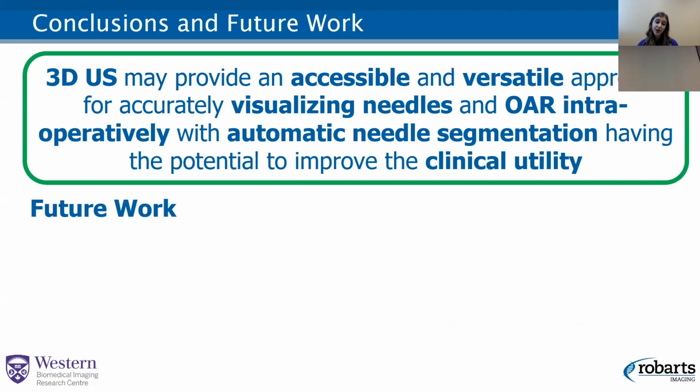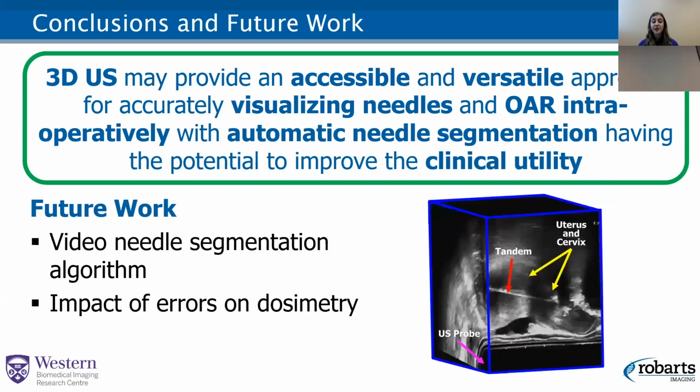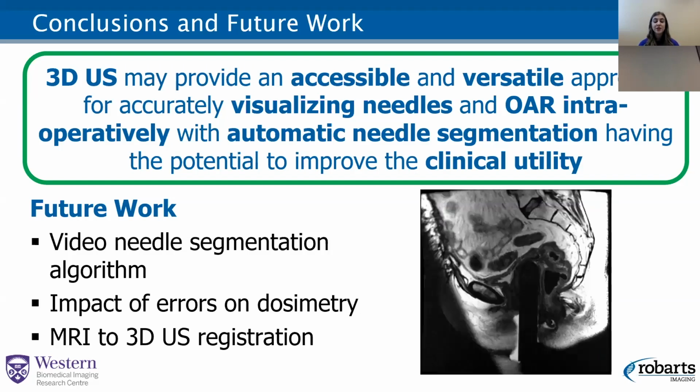So in the future, as I mentioned, we're going to look at implementing video needle segmentation for live real-time monitoring of those needle positions. We're going to look at the impact of errors that we see on the actual dosimetry and see if there's potential for planning on ultrasound images. And also look at perhaps doing an MRI to 3D ultrasound registration in order to bring more information about the tumor itself into that intraoperative environment.